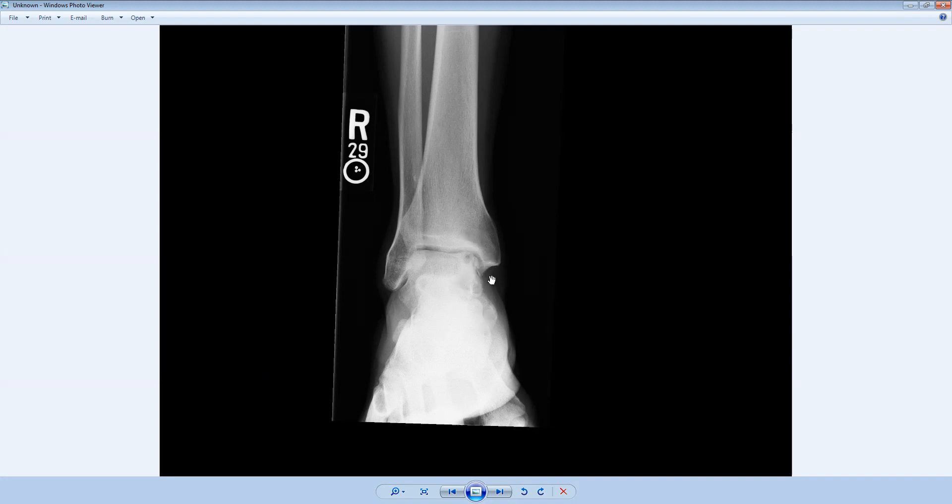We only see the subchondral lucency along the talar side of the tibial talar joint. And there are no other findings like osteophytes, joint space loss, subchondral sclerosis, other findings that suggest osteoarthritis in this case.